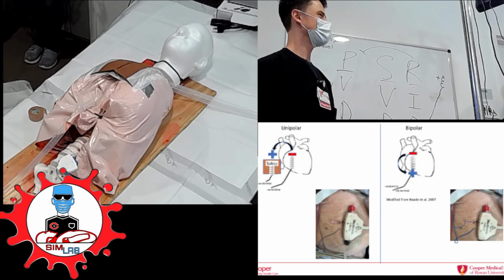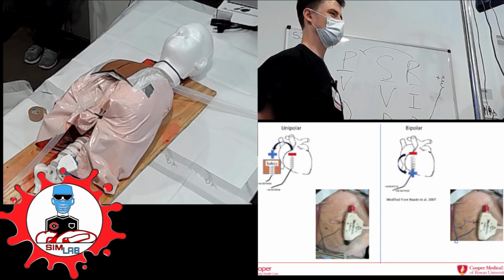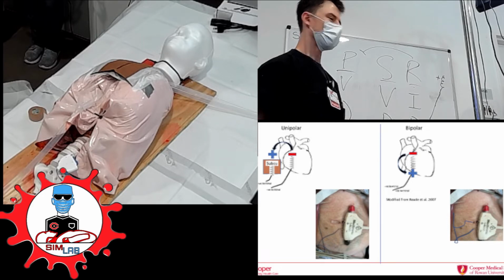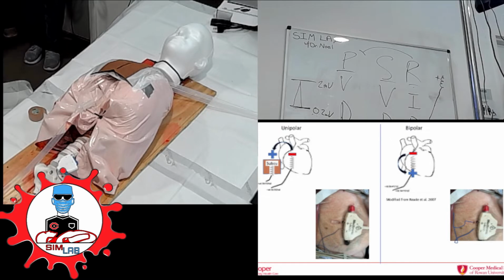So you tried transcutaneous, it's not working. You can always try to reground them too. Reground, how are you going to do that? Usually they'll keep another 18 gauge around. You stick it through the skin, and then you can put that into there. Yeah, so let me grab a needle.